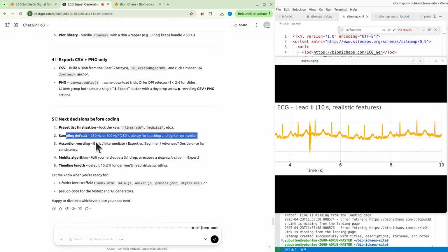Yeah, the preset list should be fine. Essentially, you make a decision on that one, on what the drop-down list should be. The sampling default, yeah, 250 should be plenty. That should be fine. Okay, generally, the basic, intermediate, expert sounds good. I'm not entirely sure what you mean by accordion wording. I assume those will be separate tabs that you could select, but ideally would like to avoid tabs and just have a single page web application. We still would like for it to fit into one screen, so everything is visible at once.